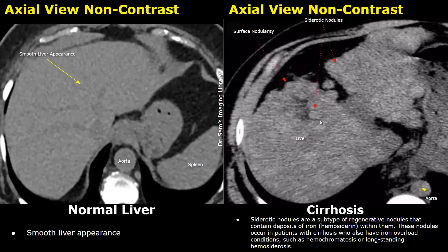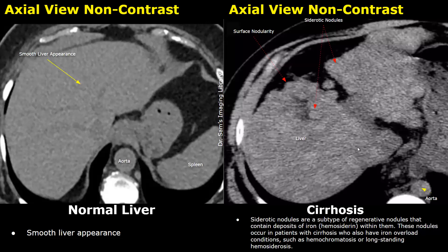Siderotic nodules are a subtype of regenerative nodules that contain deposits of iron and hemosiderin. These nodules occur in patients with cirrhosis who also have iron overload conditions such as hemochromatosis or long-standing hemosiderosis. Siderotic nodules appear more hyperdense compared to other regenerative nodules due to iron deposition. This is a non-contrast CT image and you can see many round hyperdense structures — these are siderotic nodules. Surface nodularity is also present and the liver appears somewhat reduced in size.